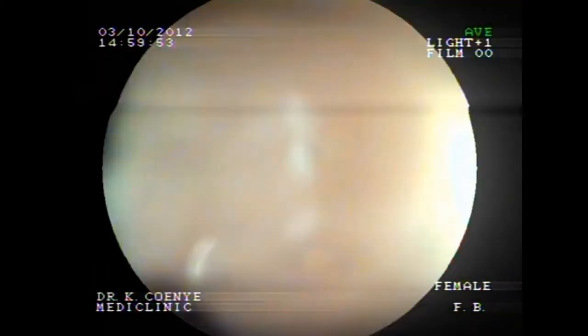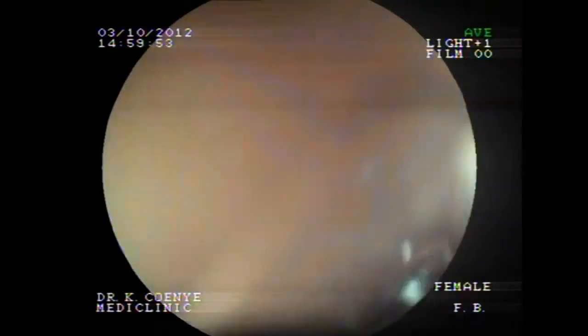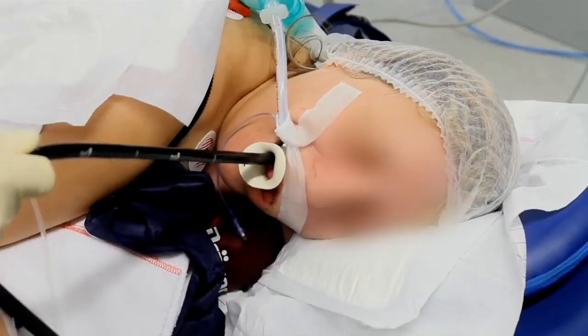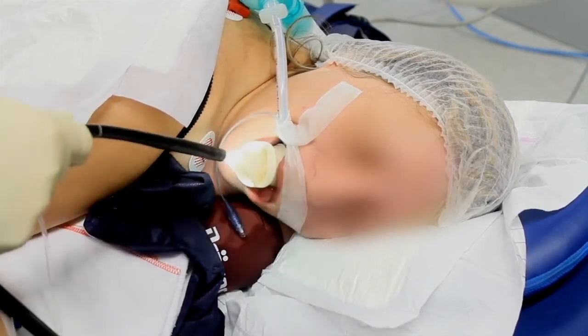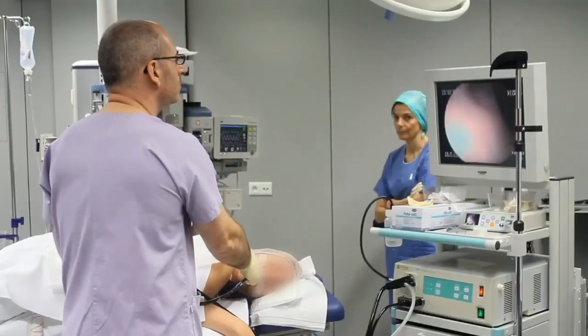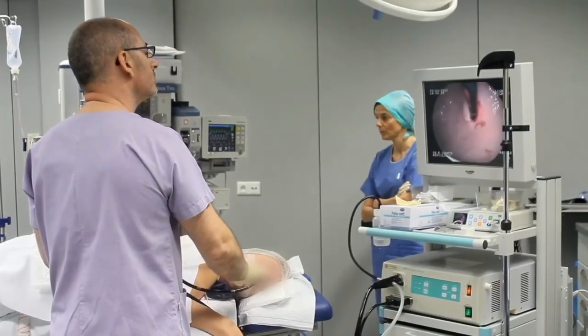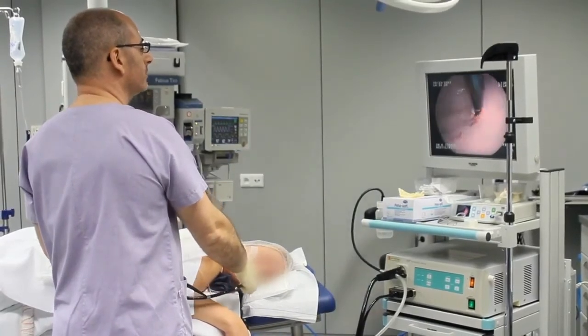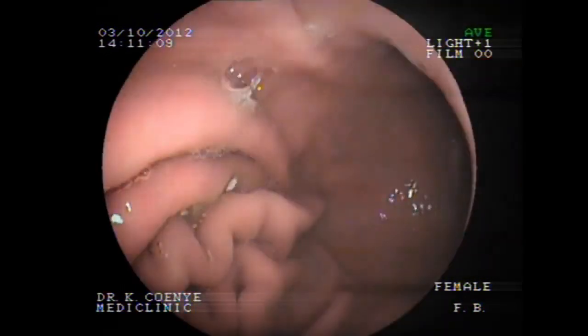Once the balloon has crossed completely the cardia orifice, bring the balloon progressively back up the esophagus, once again using a constant, moderate speed, and then cross the Killian's area very gently. Finally, withdraw the balloon from the mouth. Using the endoscope, examine the patient after the balloon has been removed to check that there are no esophageal or gastric lesions, which might have been caused during the removal of the balloon.